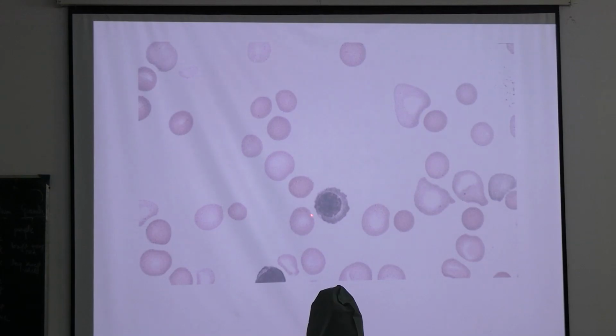Can you tell me which cell is this? No, it's not a lymphocyte. Any other guesses? Which cell is this?